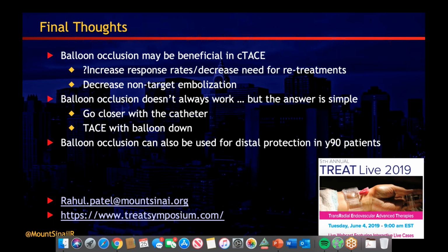So some of them won't do the balloon, but they'll use this secondary microcatheter to go out super far into the liver. That camp believes they don't really need the balloon because they're going to go out super selective like that and really just jam in the chemo as much as they can. Yeah, they've definitely gone into two camps there.